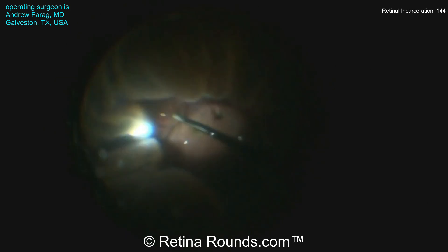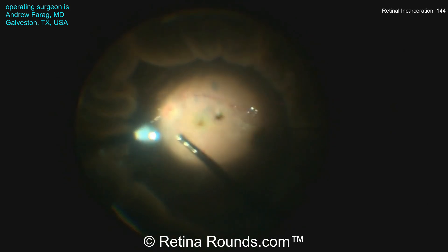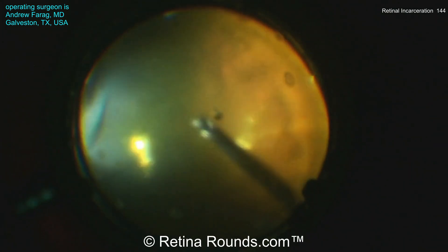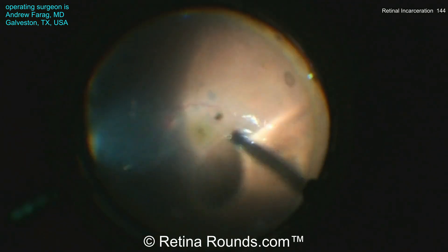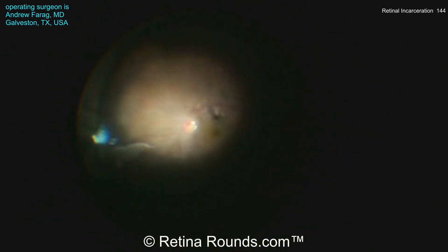A few areas of preretinal membranes are peeled, and then perfluorocarbon liquid (PFL) is instilled over the posterior pole. The retina looks pretty good overall — the macula is looking well and the patient may have reasonable vision potential. The proteinaceous, thick subretinal fluid (Schlieren) is being squeegeed out using the PFL and aspirated for good visualization. A supranasal retinal fold is visible and will need to be addressed.